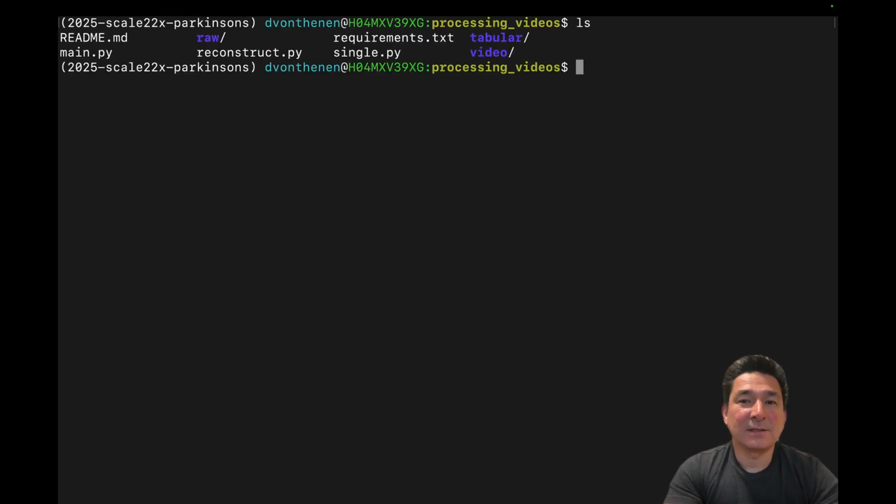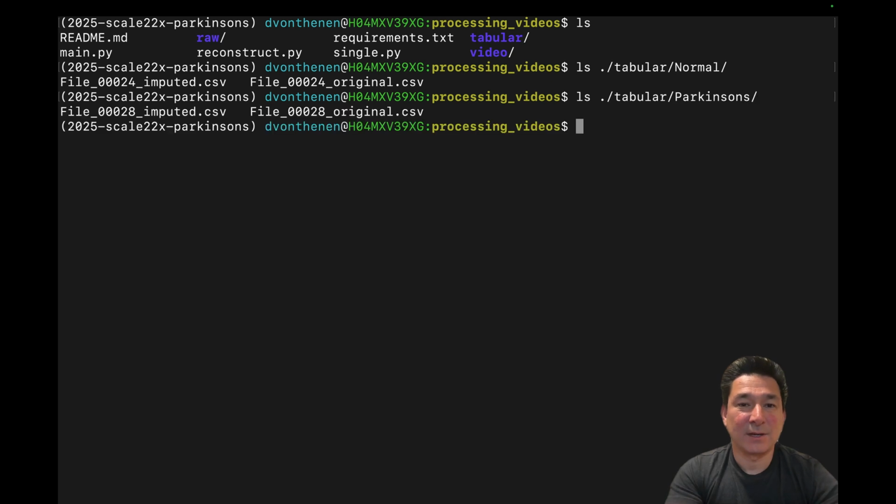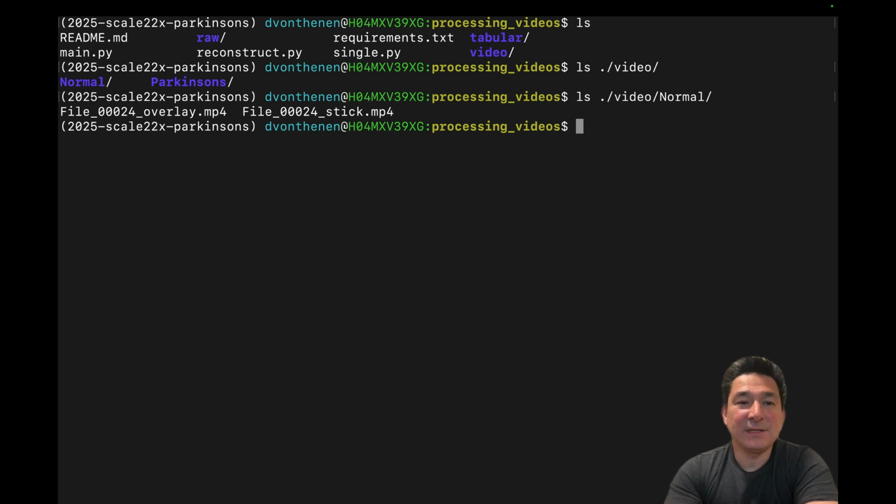So you can see here that the process has created two new folders. One is tabular and the other one's video. If you look into the tabular folder, you can see that we have CSV files created for the normal walking pattern, and then also CSV files created for the Parkinson's walking pattern. The second folder is a video folder. If you look into it, you can see that we have the stick figure video, and we've overlaid it on top of the original video, which is overlay.mp4.